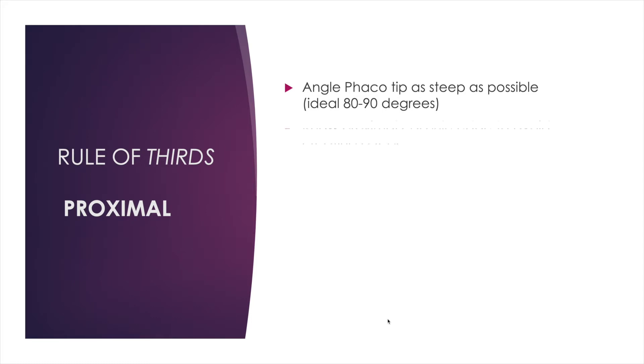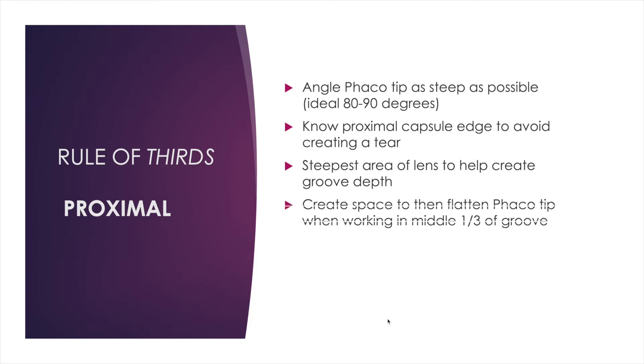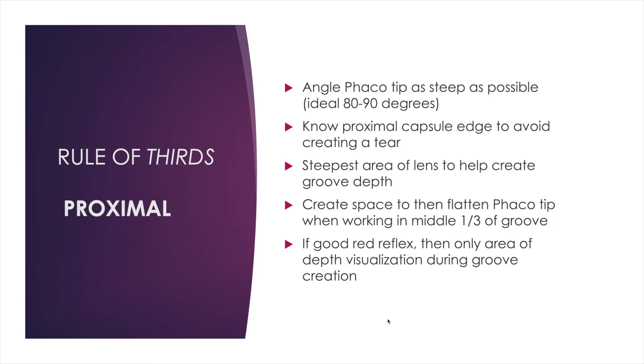I go to the edge of the proximal capsulotomy, being careful not to rip it with the phaco needle, and I angle as steep as possible—80 to 90 degrees. This is one of the more critical steps of creating a groove because it's the deepest area of the lens, and it will really set the stage for the rest of your groove and set you up for cracking as well.